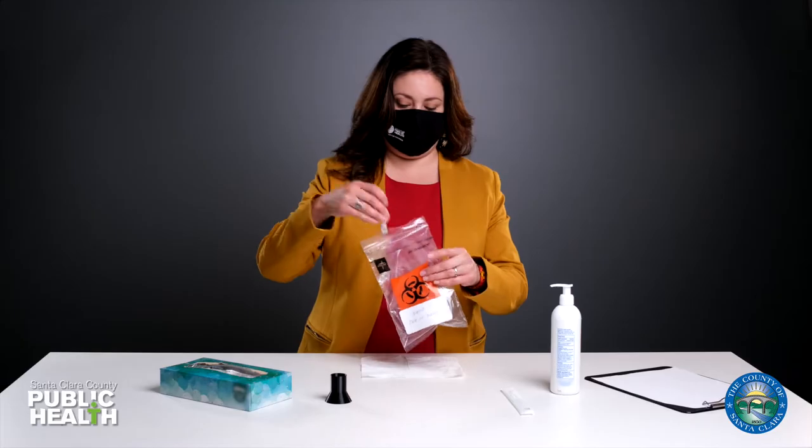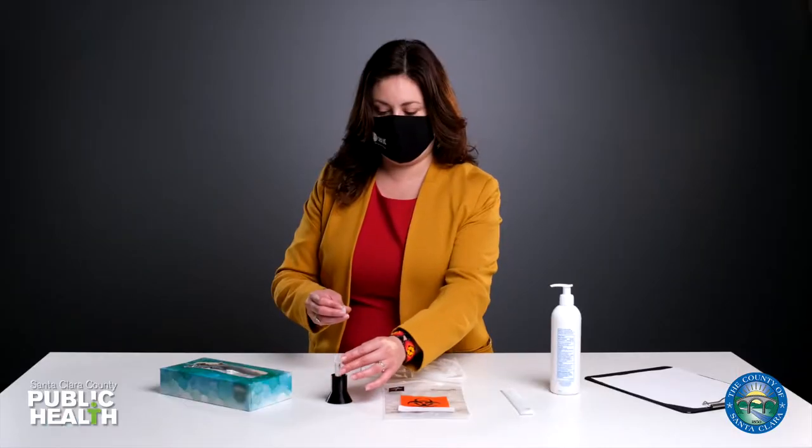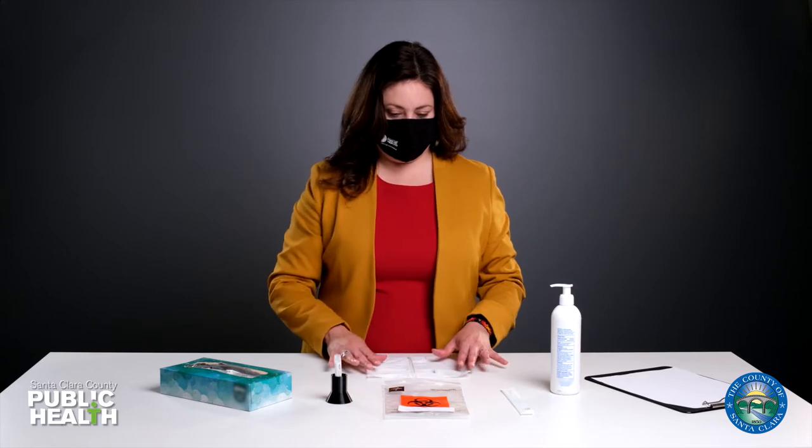Take out the test tube and unscrew the lid. Then place the tube in the holder and the tube cap on the tissue paper.